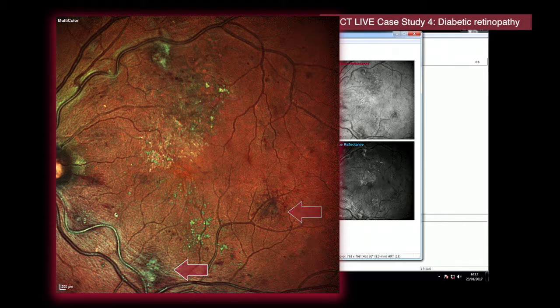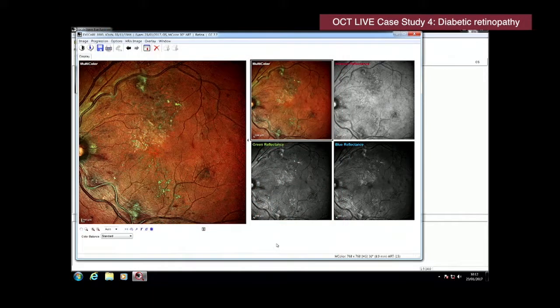Okay, because this image is a multicolour image. It requires infrared, green, and blue light all simultaneously. We also be able to pick out the areas of leakage within a colour image. And if you think about diabetic retinopathy, all the changes in diabetic retinopathy can be very simply explained by one statement. It's caused by leaking retinal capillaries or blocked retinal capillaries. Okay? And what we're seeing here is very obviously signs of leakage. Okay? So these leaking retinal capillaries, breakdown in blood-retinal barrier.